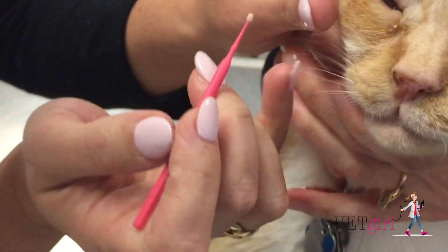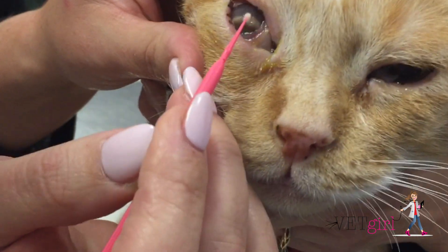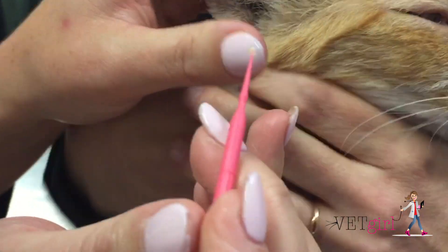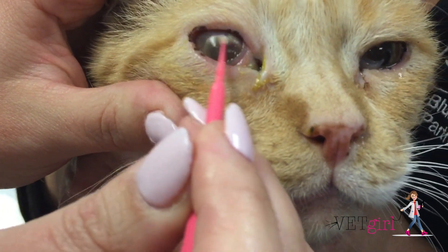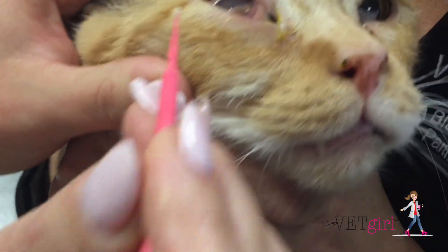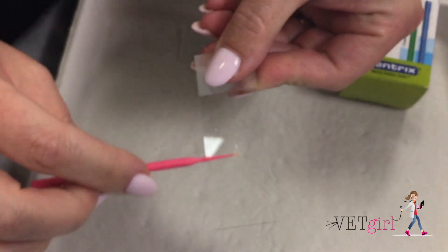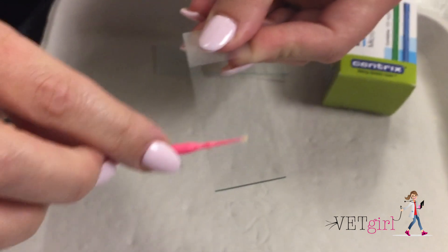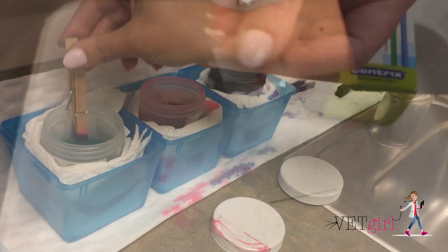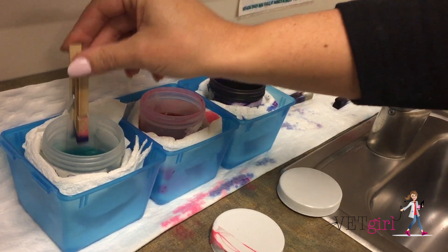As shown in the video, the assistant is properly stabilizing the cat's head by placing one hand under the chin and the other behind the head. The clinician then uses the blunt end of the blade or cyto brush to gently scrape the area of cellular infiltration to obtain an adequate sample. The sample is then directly smeared onto a glass slide, stained, and evaluated under the microscope.